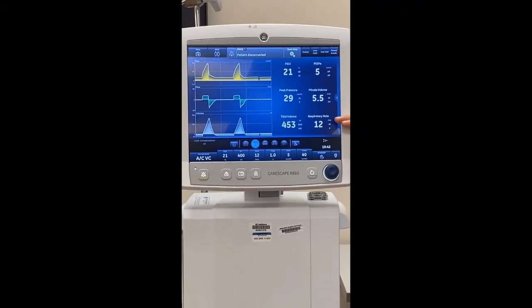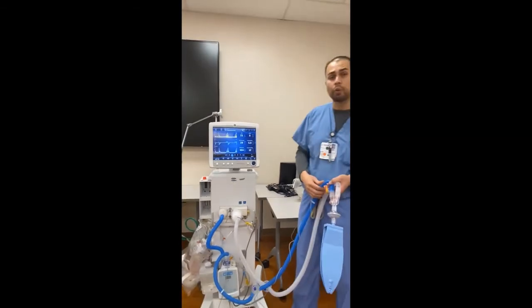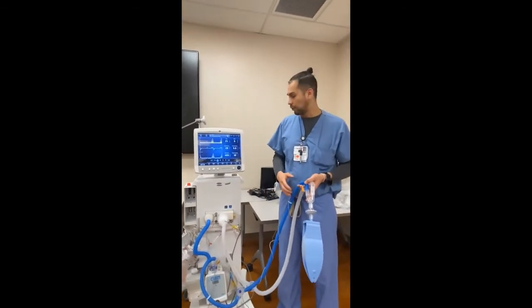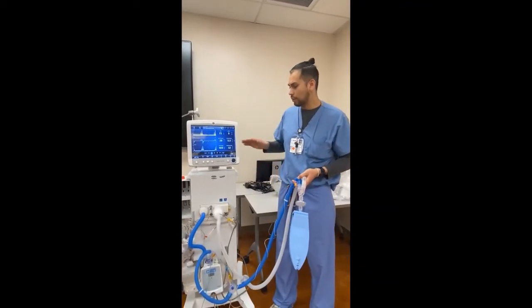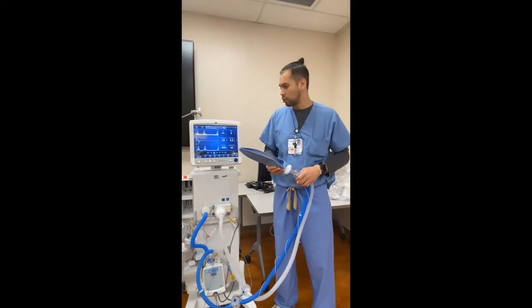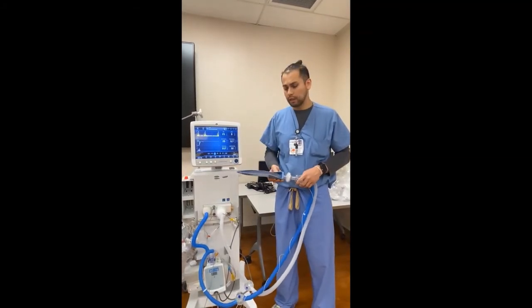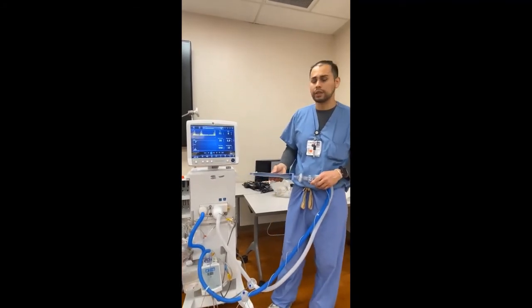And our respiratory rate. If the patient is waking up from their sedation and they're unable to wean at this time, we definitely want to see if we can get them stable back on sedation so that they're not breathing way over the vent. Chances are they could be breathing 20 or 30 breaths per minute, and we definitely need to keep them stable while on the ventilator until it's their time to come off their vent.